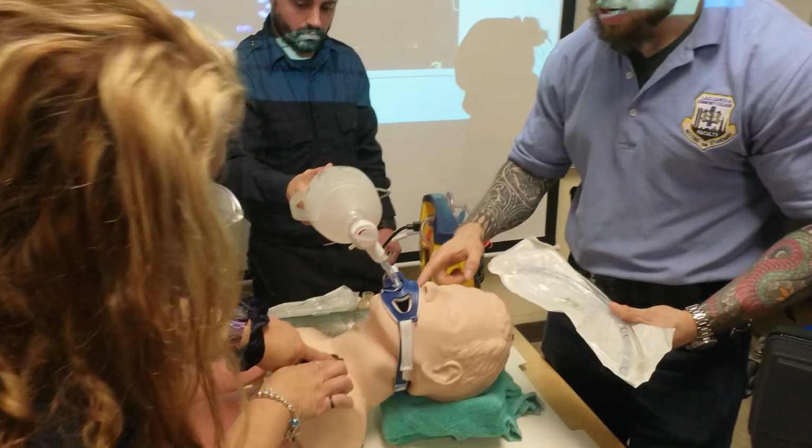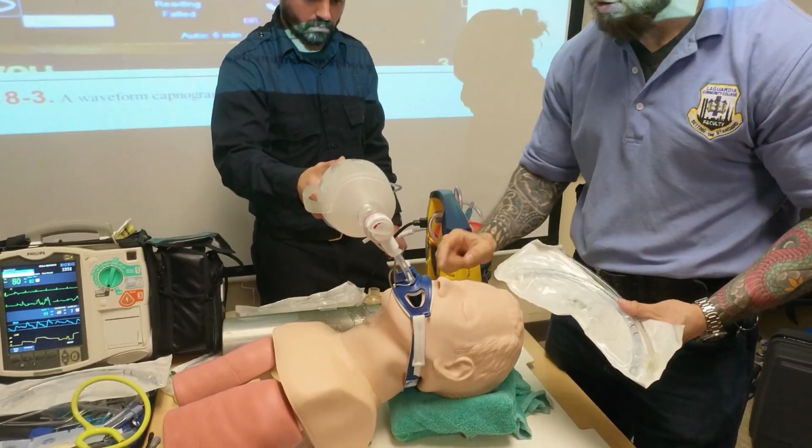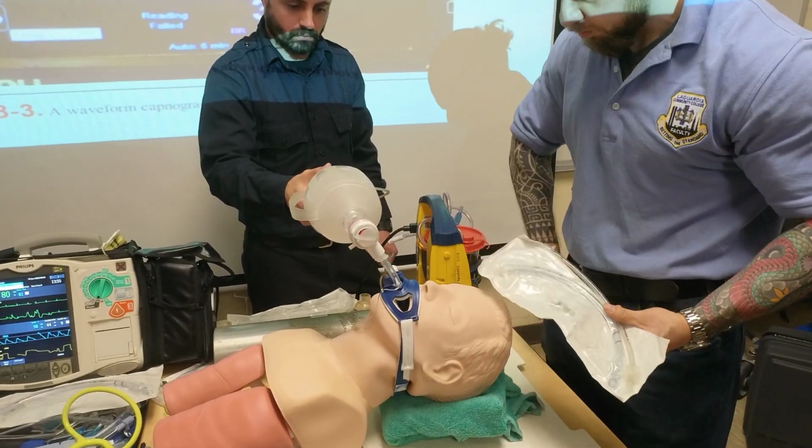So right now, when you enter this tube, like you said, Nick, that's the reason for positioning, because I want to align the oral axis, pharyngeal axis, and laryngeal axis. If I don't put this in this position, I cannot see it as well. I cannot see that. Sorry, whoever's behind you.